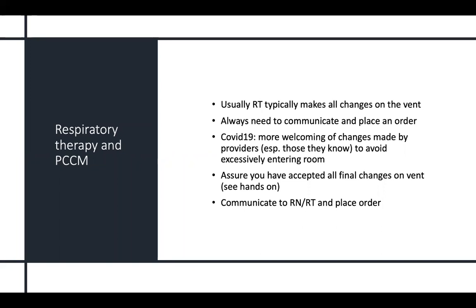That being said, it's very essential that any changes that you're making on the ventilator are accepted completely. What I mean by that is, as I'll show you on the hands-on portion separately, oftentimes that final accept isn't done and the patient may remain on pressure support and have inadequate ventilation, and you think that you've changed them to volume control.